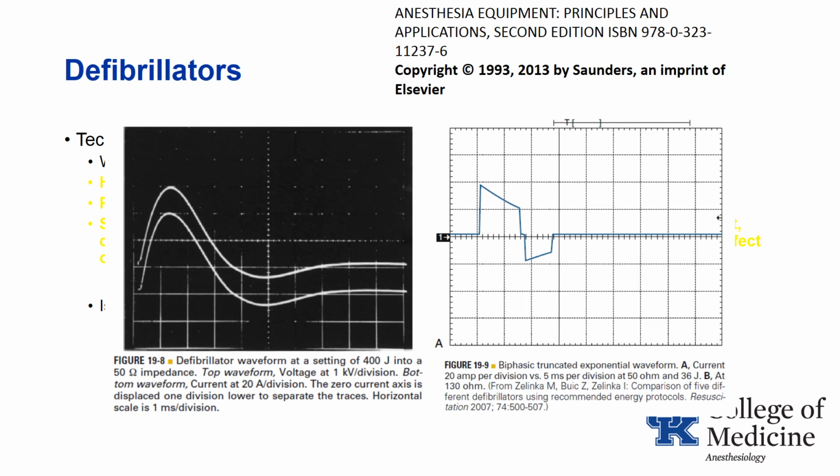This slide and its two figures from that chapter show the old underdamped defibrillator waveform on the left and the new truncated exponential waveform on the right.